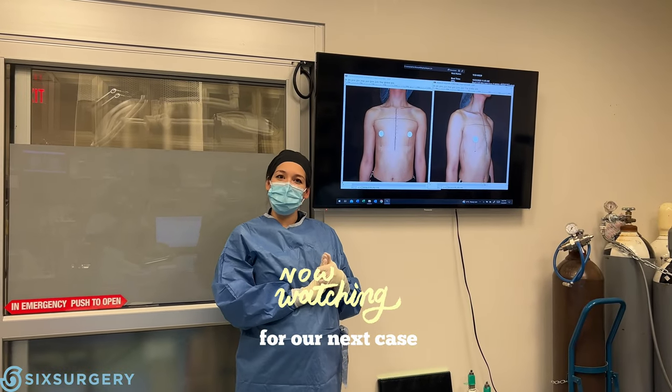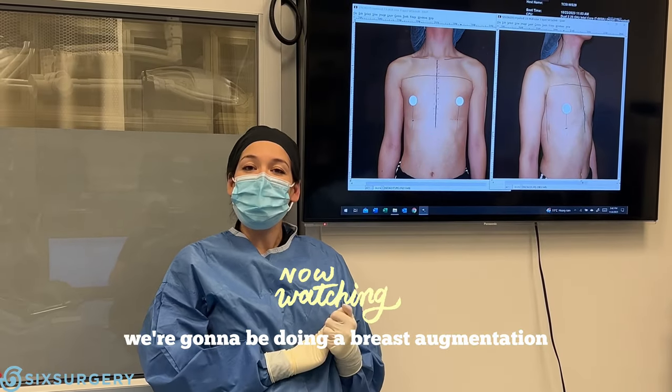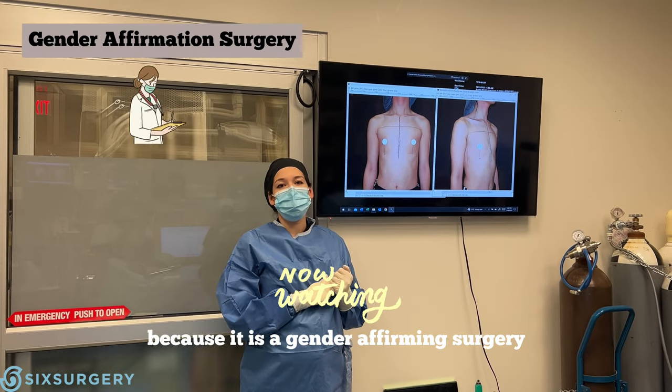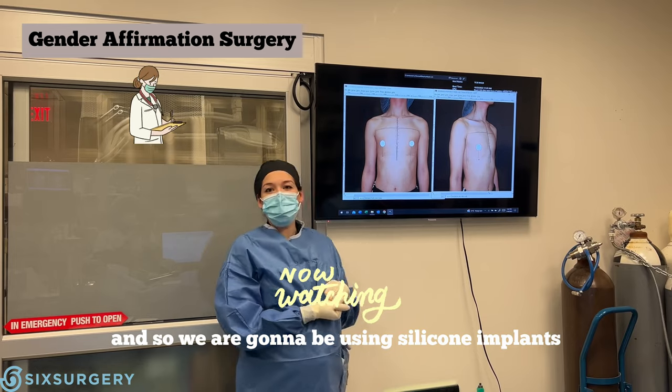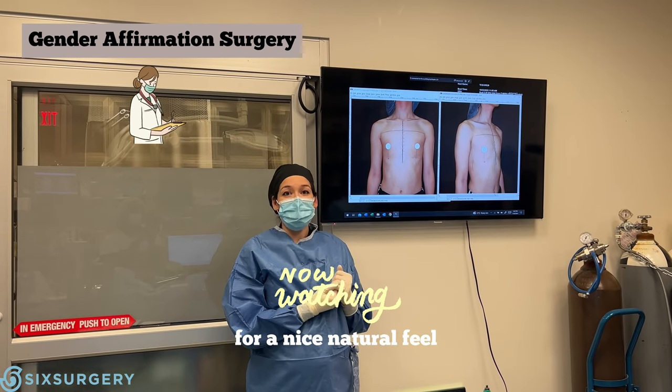Hey guys, welcome to the OR. For our next case, we're going to be doing a breast augmentation. This is a special breast augmentation because it is a gender-affirming surgery for this patient. We are going to be using silicone implants for a nice natural feel.